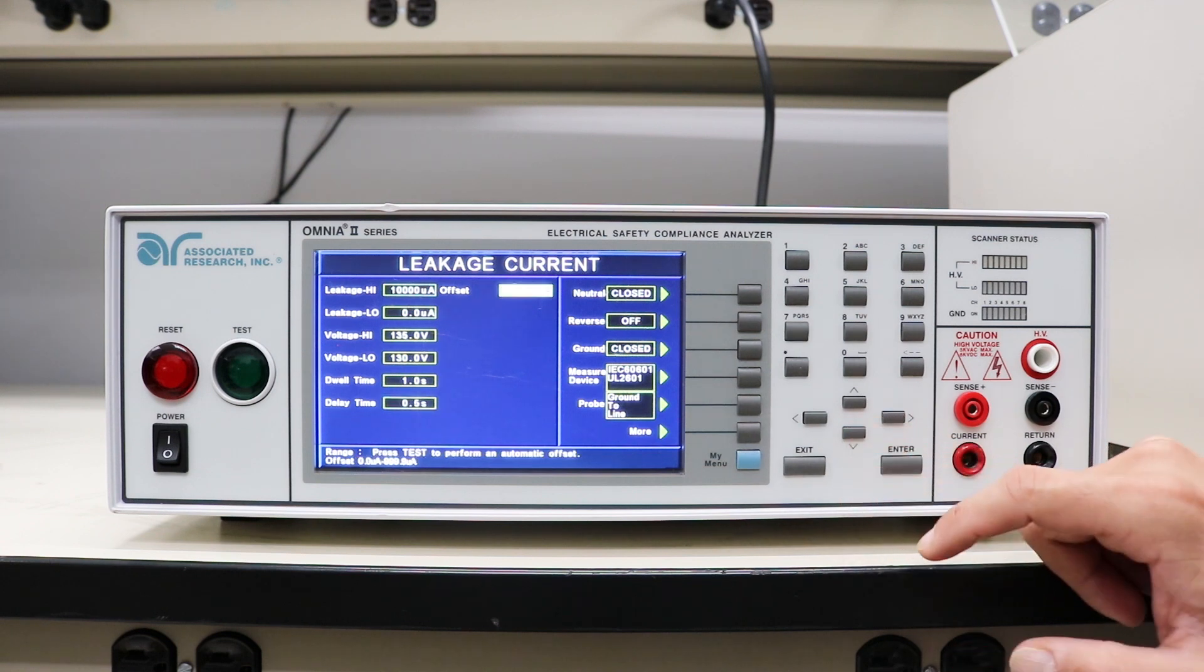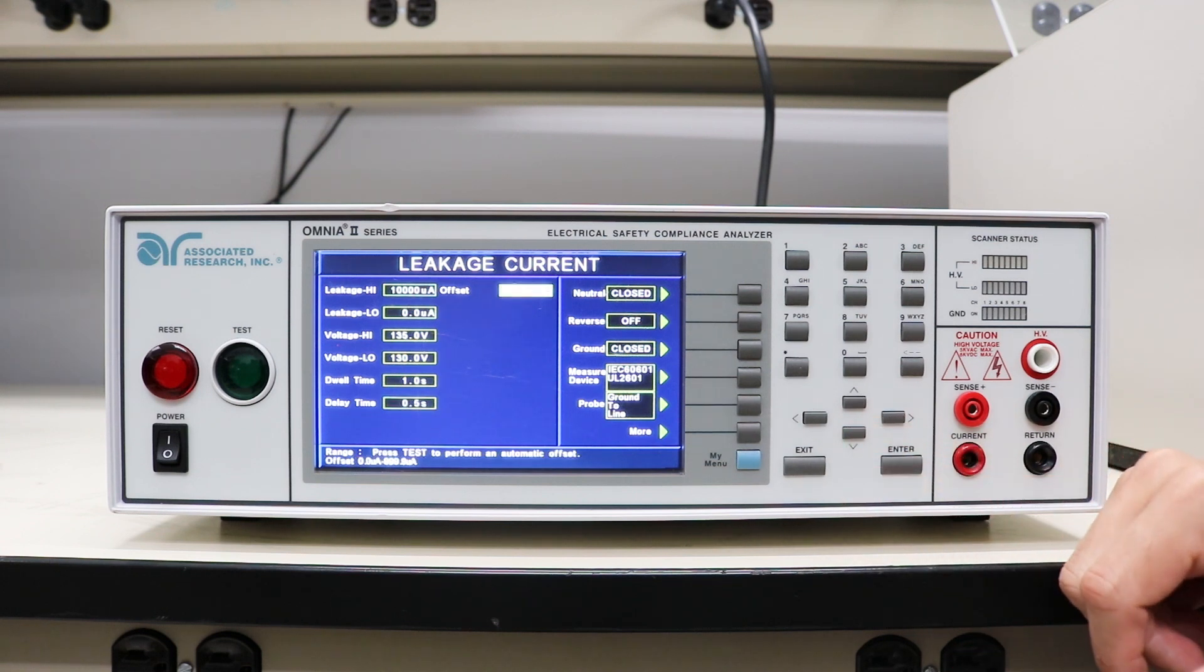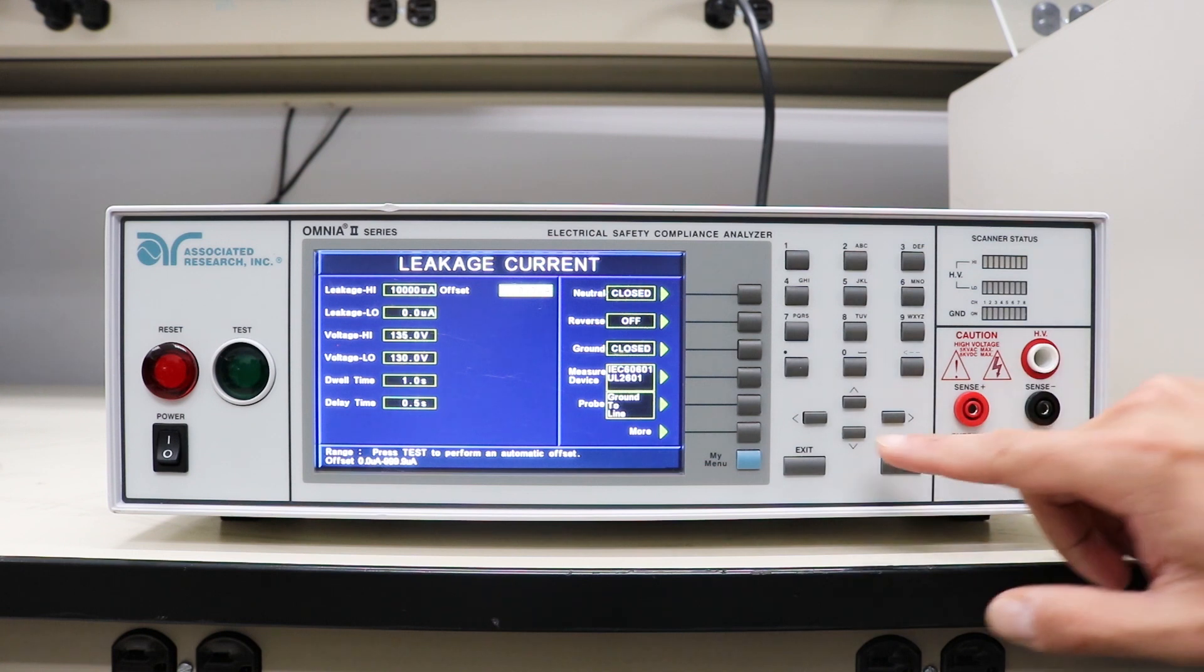That's followed by the offset parameter. If you run into issues with extra leakage current or system leakage, you can always use this parameter to offset any stray leakage that you're going to see.